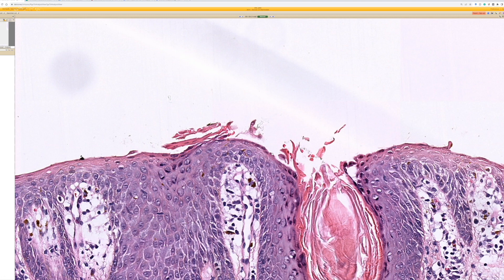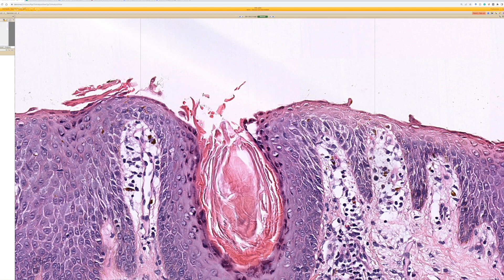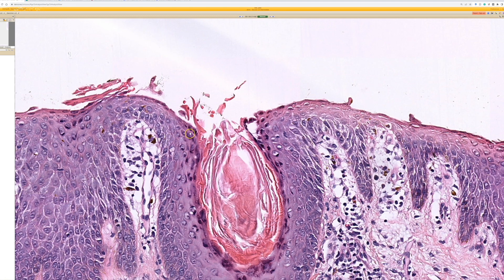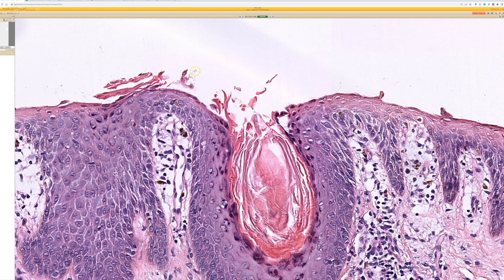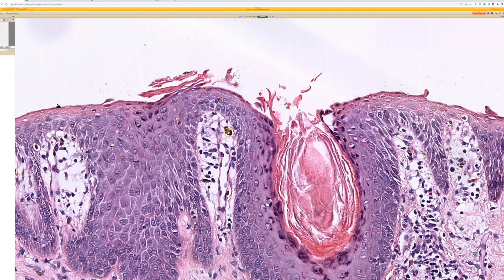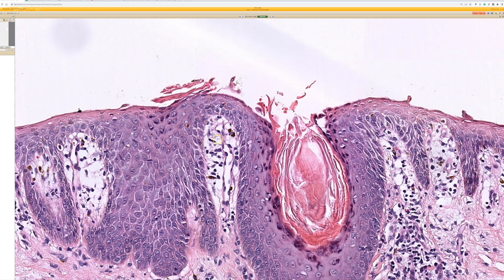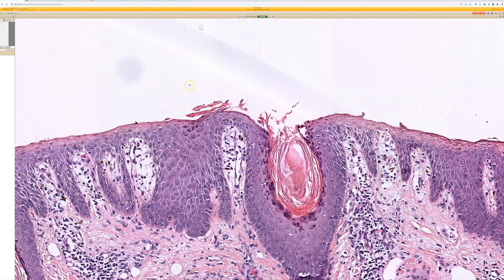I don't have a reliable way to tell those two apart. The other thing would be bullous impetigo. Although in bullous impetigo, you usually see neutrophils and bacteria in the blister space, but if it washed out and sloughed away, it could look like this. I've also seen times where pemphigus foliaceus had secondary bacterial impetiginization and made me think of bullous impetigo, but in the end it was confirmed by direct immunofluorescence to be pemphigus foliaceus. So it's good to keep those three things in mind when you have the missing stratum corneum or a subcorneal split with acantholysis.